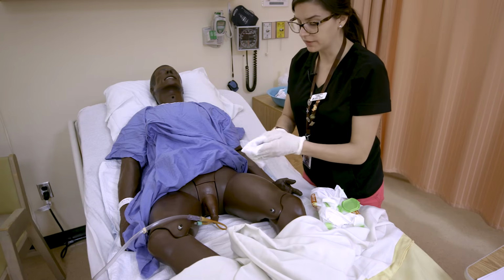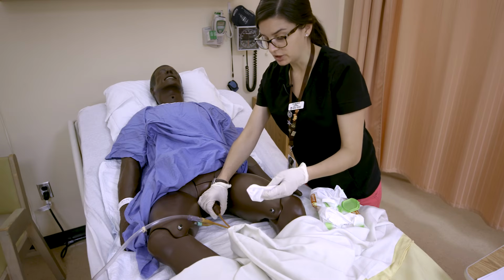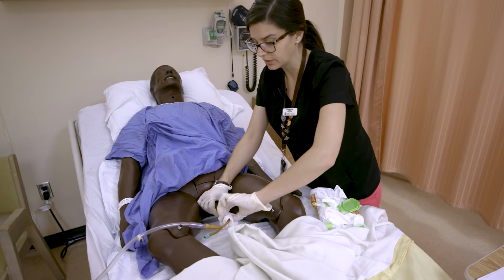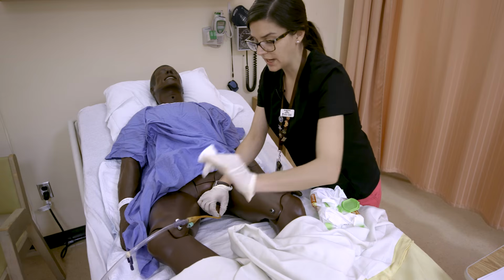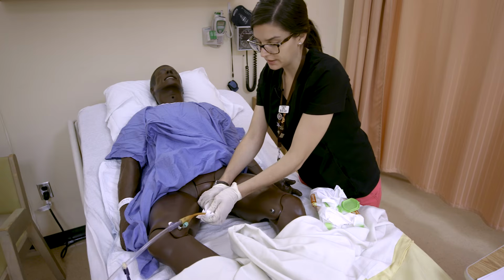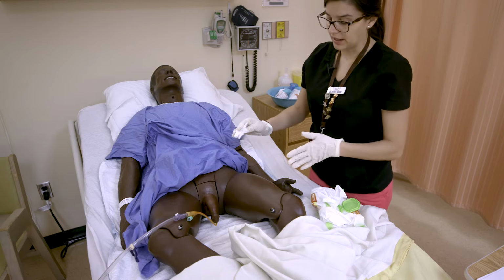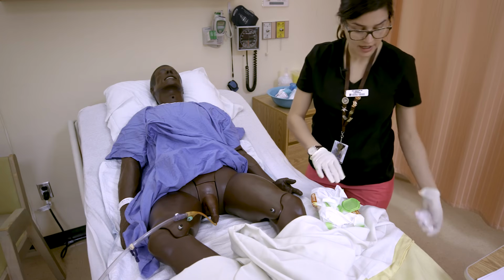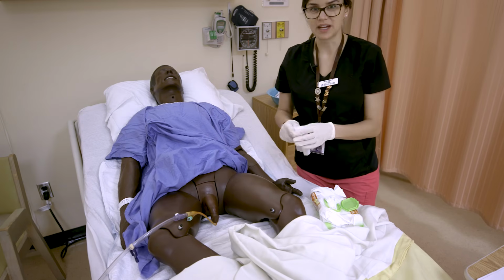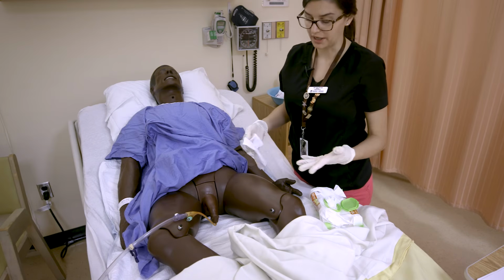And you can kind of fold your cloth so that you can use a new side of the cloth for each wipe. We're going to want to stabilize the catheter here so that we don't inadvertently pull it out. And we're going to clean down the catheter away from the patient. So now I'm going to switch to a clean side of the catheter and do the rest of it. So you would want to do that until it was clean. And then again, you can grab a new wipe and clean around their groin area if it was contaminated, being careful not to move contaminants onto or near the catheter.